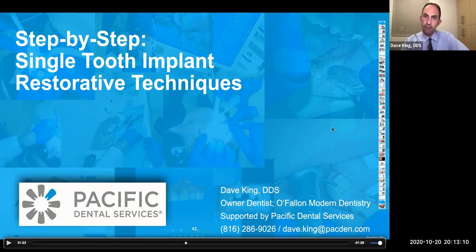So in the end, I know it's kind of a cop-out, a lot of it is based on the clinical situation and what you find when you get there. If you're the surgeon placing the implant, you're putting that pilot drill in there for the first time, you're touching the bone, and it's rock solid, as dense as stone, then you're probably good with just 4. On the other hand, if you come up with some type 2 bone, type 3 bone, then you may want to consider more implants to hedge your bets.